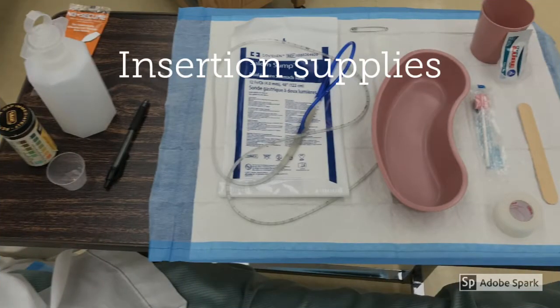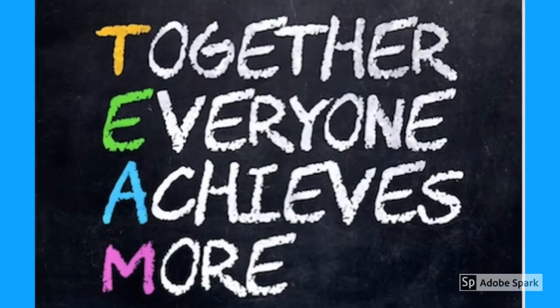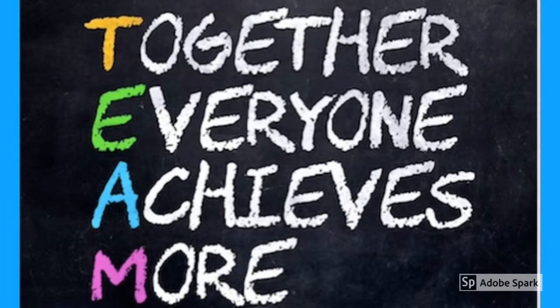We also need a cup of water with a straw, but only if your patient is able to swallow. If your patient is going to aspirate, don't give them water to drink. That's a bad idea. You should also grab an emesis basin and chucks because, well, this does stimulate the gag reflex, and someone could have a need for those items. Just saying. While you're out there getting your stuff, make sure you grab a packet of lube because that tube isn't going down easily without it. Because we only have 2 hands, you might want to grab a second person to help you hold the cup or the emesis basin and to instruct your patient while you're trying to insert the tube.